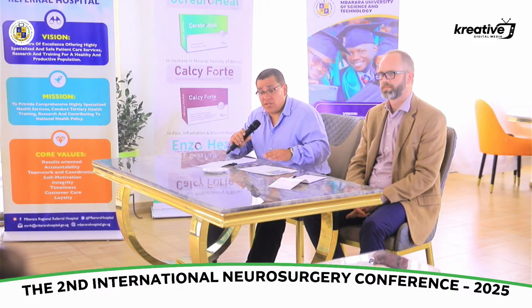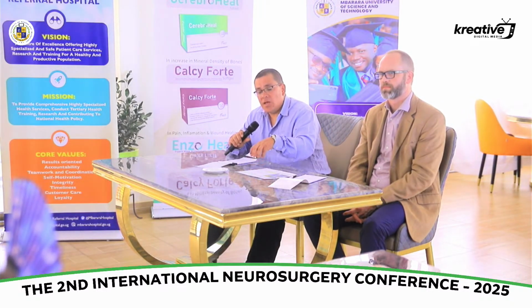And as far as the ICP goes, there is a parameter in the transcranial Dopplers that is a pulsatility index, and another one that's also called the resistivity index, that basically tells you how much resistance to blood flow you're encountering in the patient's brain. The more resistance that you encounter, there is pressure that is fighting against that. So it's not going to tell you the ICP is 20 or the ICP is 5. But in the proper clinical setting, let's say somebody with a TBI with a low GCS, if those parameters are high, the pulsatility index for example, then you have a high suspicion that that patient has increased ICPs, and you should treat it as such.